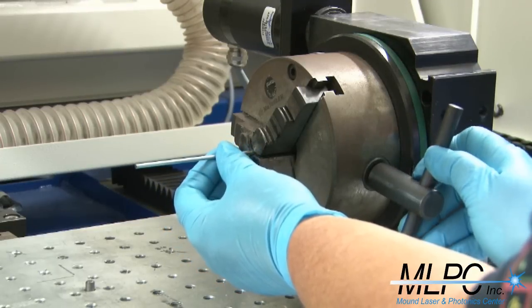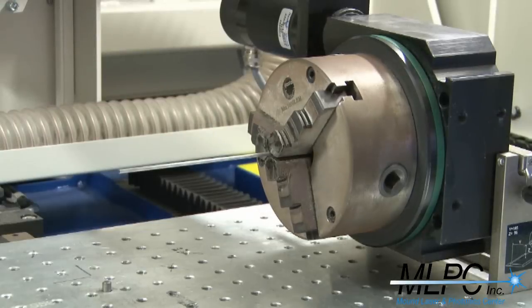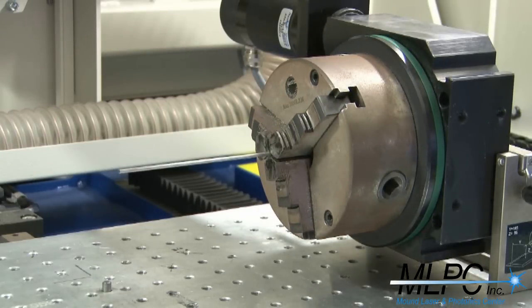After laser welding, the part is taken to the laser marking department. The part receives a dark mark with measurement lines.